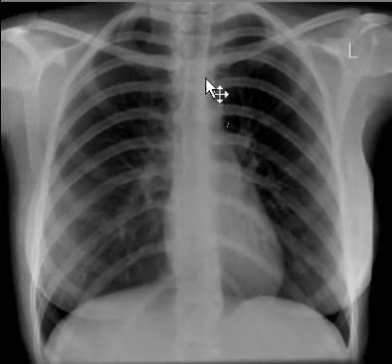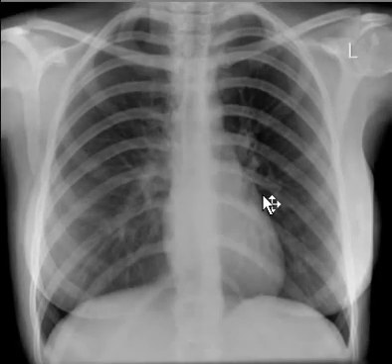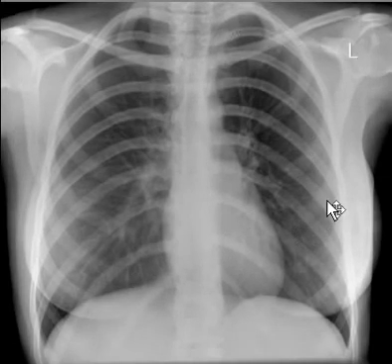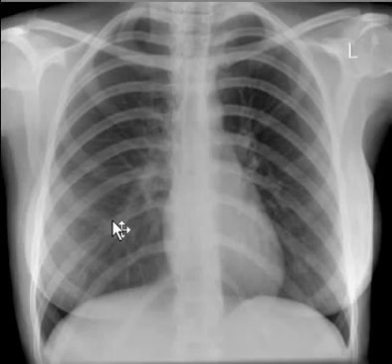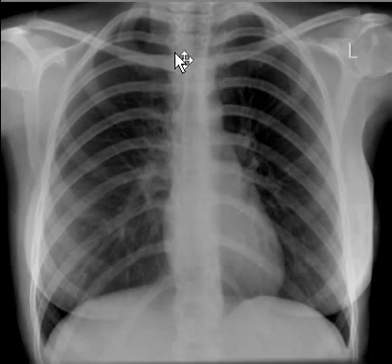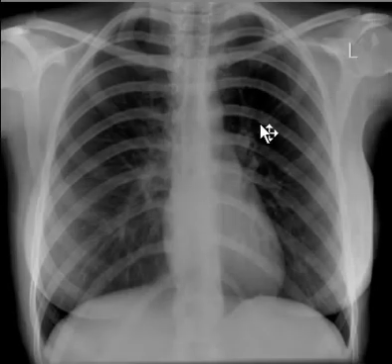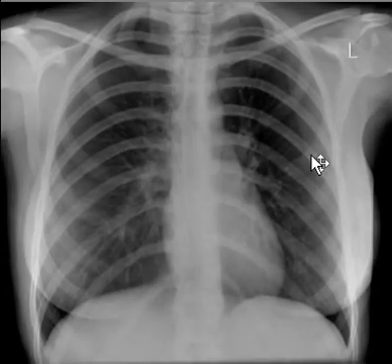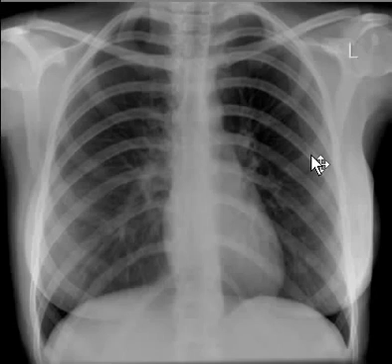The trachea is central in this example, but gray scales are not symmetrical over both lungs. The left lung looks a bit darker in the upper zone compared to the right lung. However, in this particular patient this does not represent pathology, because the patient is slightly rotated towards the left side. The medial end of the right clavicle is projecting over the thoracic spine, whereas the medial end of the left clavicle is projected away from the thoracic spine. When a patient is rotated to either side, you may see asymmetry of gray scales.